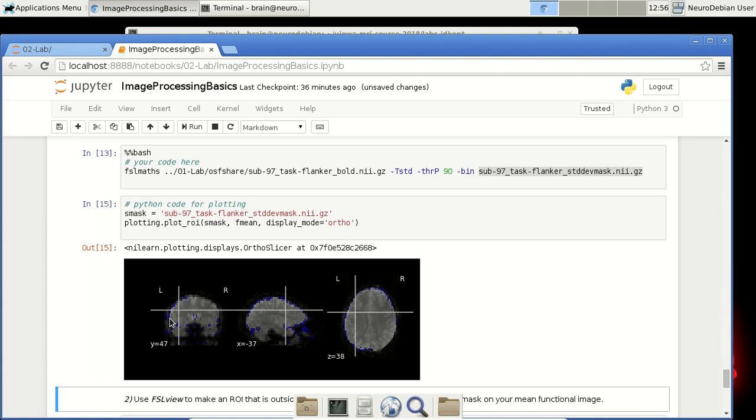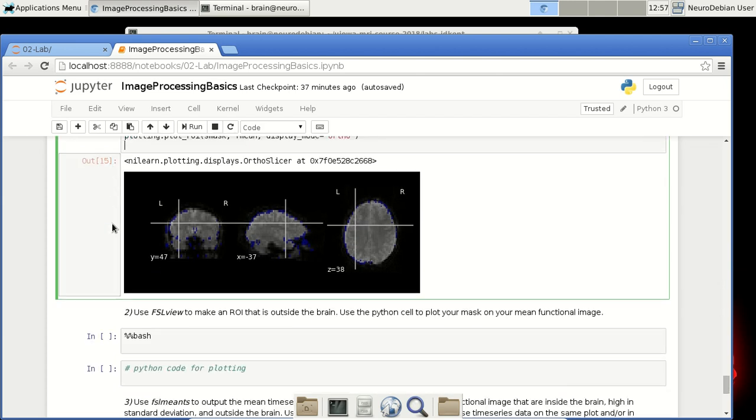Say for one volume, the person's head moved into that space, so we had the brighter voxels from the gray matter, then for another volume, the head moved away, so those voxels, instead of representing the brain, now represented the skull or the dura mater or someplace in between. So with the minute movements that the participant makes within the scanner, they are picked up along the edges here, or at least that's where they're most visible. So yeah, we'd see a lot of standard deviation in those, and that makes sense to me.